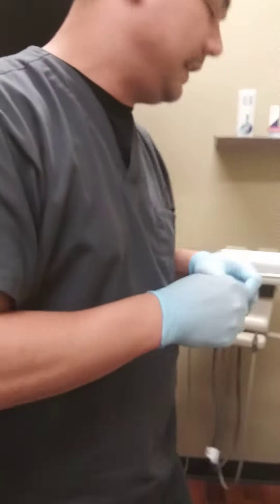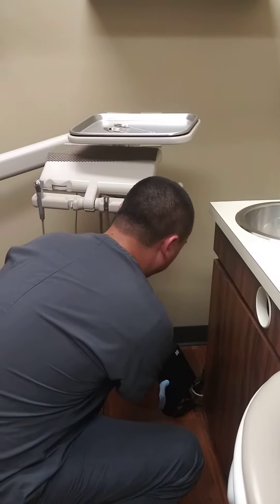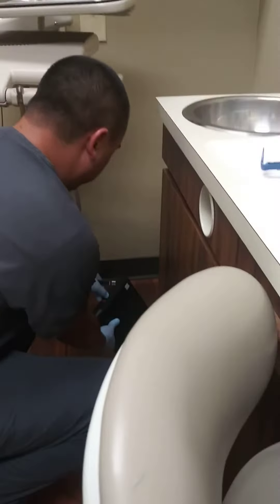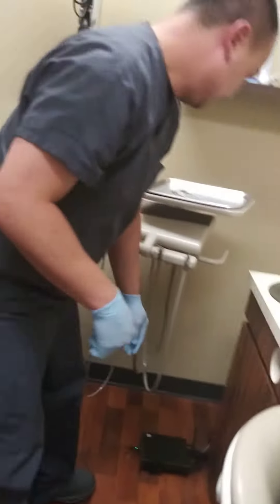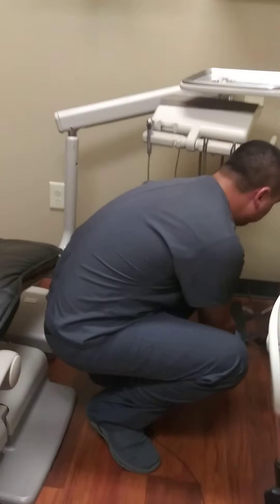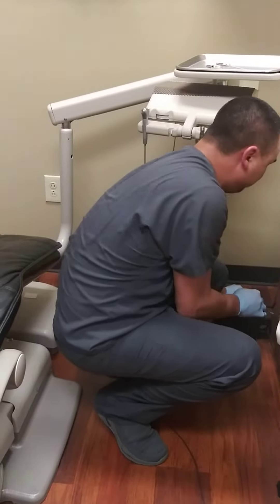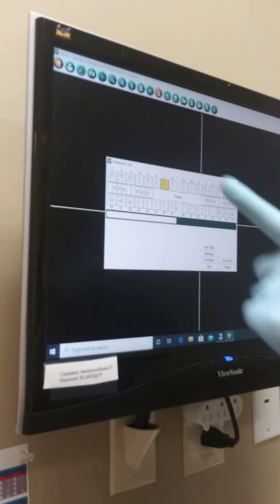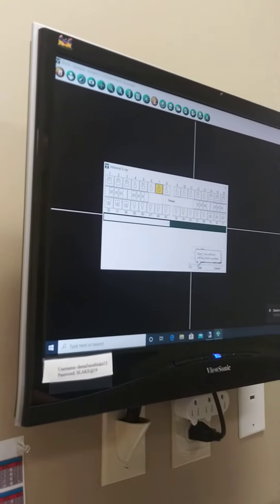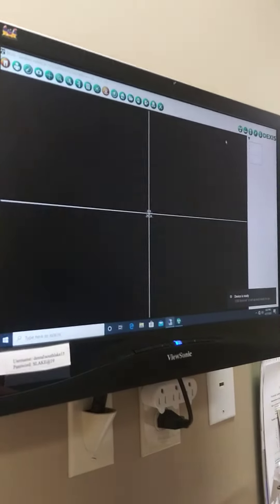I need to plug this up real quick, and then we can get started. Of course, you want to have all this done prior to getting this prepared with the patient. Okay, this is where we come directly to the computer. Let's do another number seven. This is using Dexis. We are ready to start taking this x-ray.